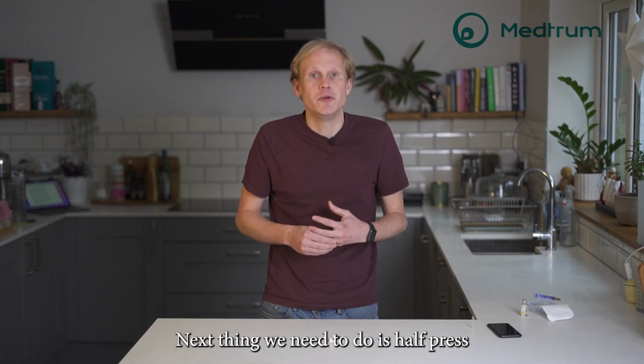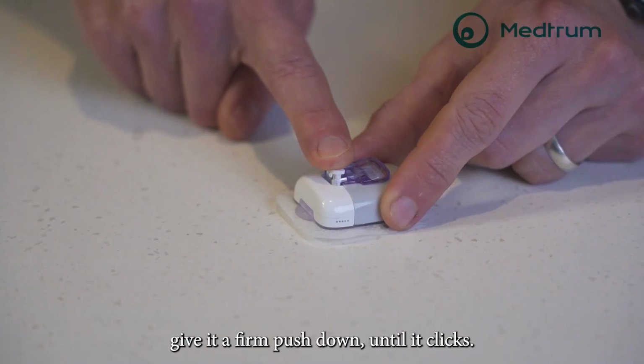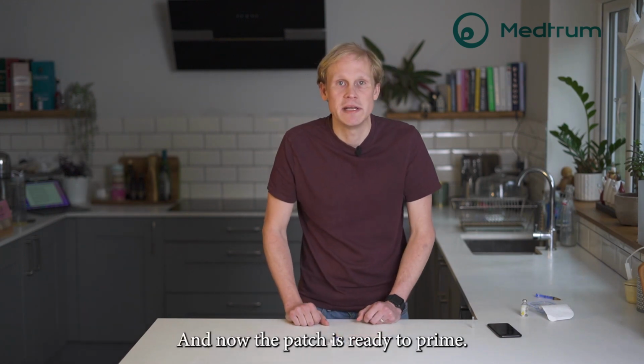The next thing we need to do is half press our needle button. In one motion, give it a firm push down until it clicks, and now the patch is ready to prime.